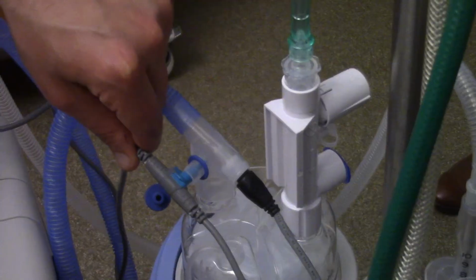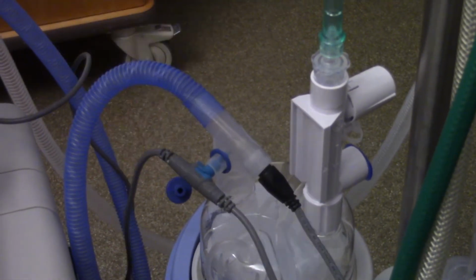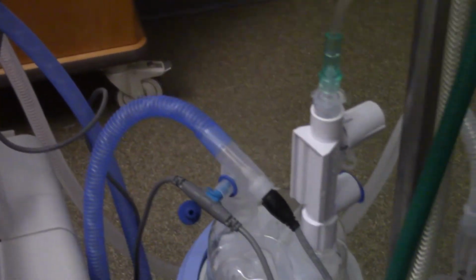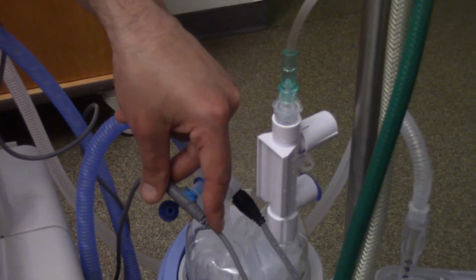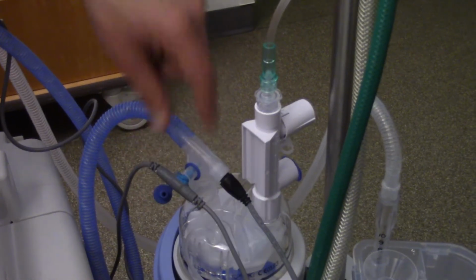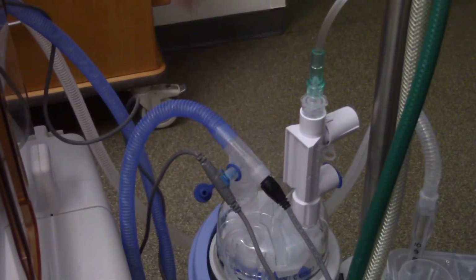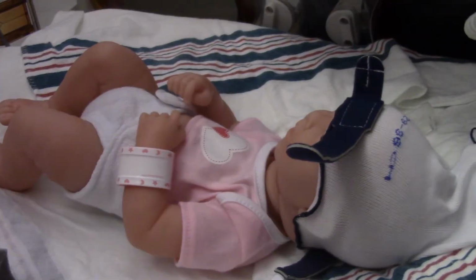These cords, unfortunately, are notorious for getting caught, whether we're putting one of the side rails down, moving a chair, whatever happens, they do get caught. So just ensure that if you don't have a strong bubble, look at mechanical, and then assess and make sure that the patient is getting the proper therapy.